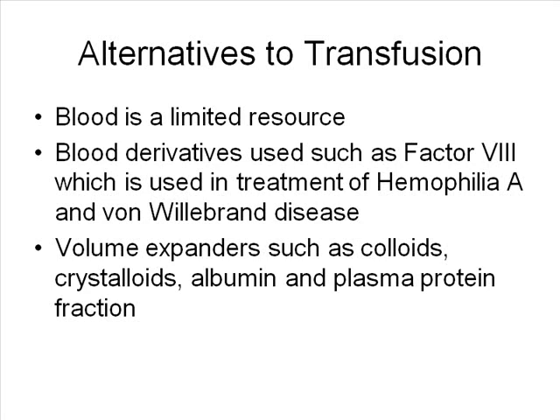That will completely change everything. Now remember, with donor selection, meaning if you are actually donating, I don't think it's going to change that very much, but it will change the way we do things in the blood bank, because we won't be doing ABO on those units of blood anymore. So the way we process and hand out blood in a clinic or hospital is going to be totally different.